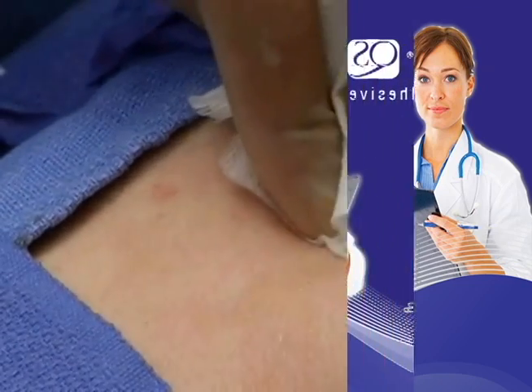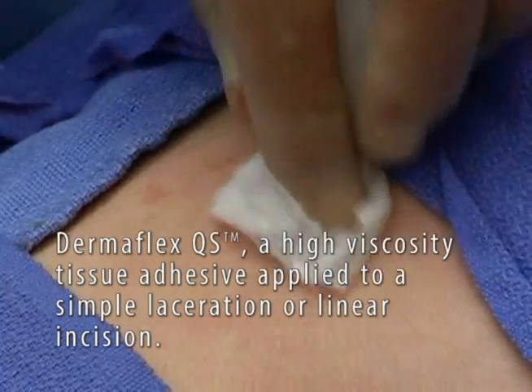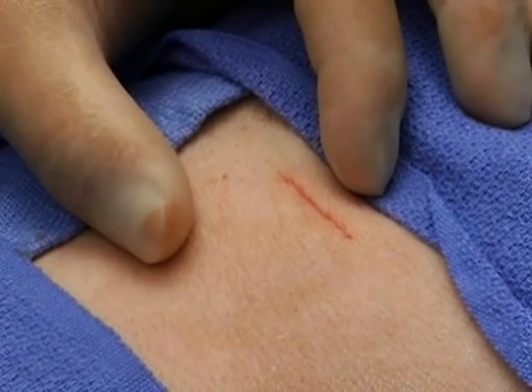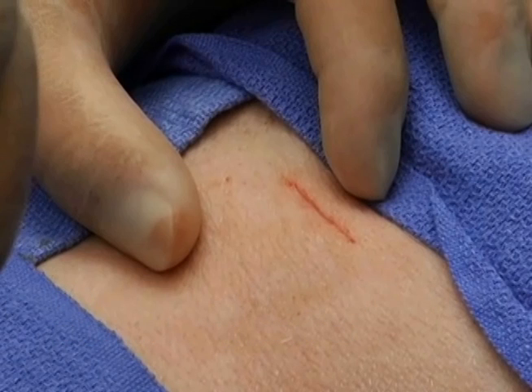Here we see a demonstration of Dermaflex QS high viscosity tissue adhesive applied to a simple laceration or a linear incision. A little bigger than a minimally invasive skin port, and the wound can be closed with minimal finger tension.